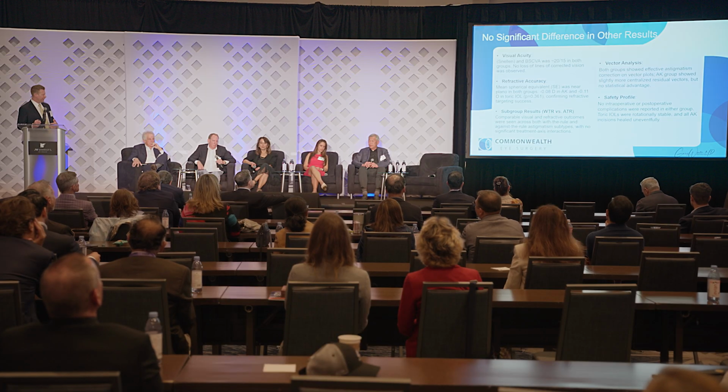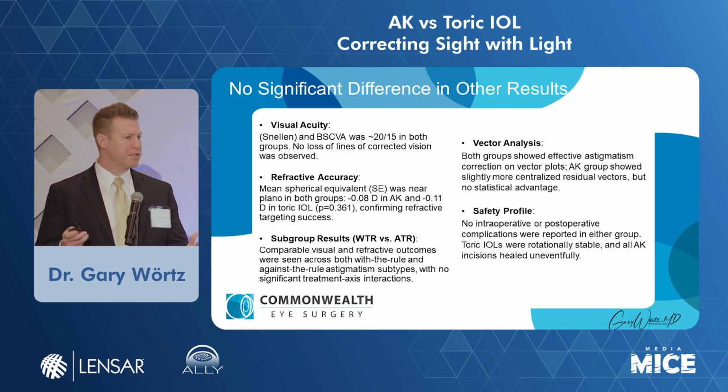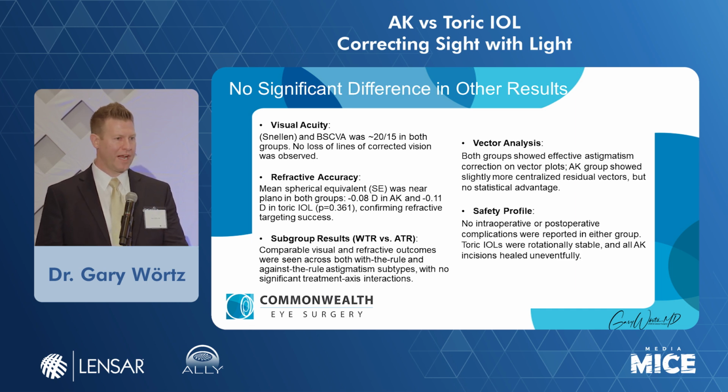Some people will make an argument that an AK can induce irregularities. We didn't see any of that. With refractive accuracy, we were close to plano in both groups. Again, equivalent, confirming our refractive targeting success. We also did subgroup analyses. So we looked at the with-the-rule group versus the against-the-rule group and found the exact same trends. A little bit higher preoperative astigmatism with the toric group than the AK group. But in terms of the outcomes, whether it was astigmatism correction or uncorrected vision or spherical equivalent refraction, there was no statistically significant difference in either group.